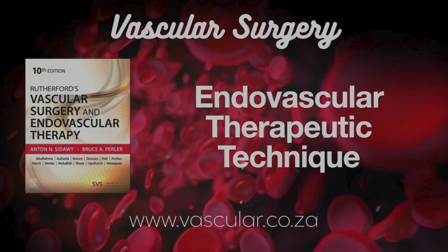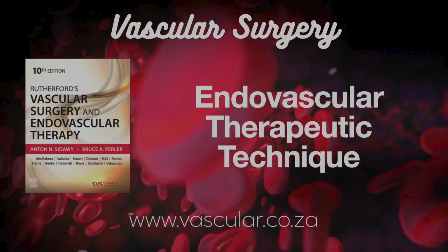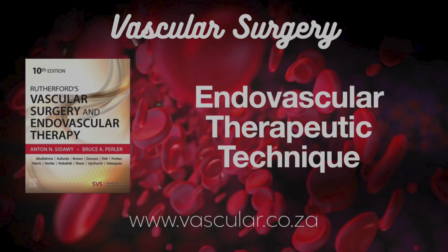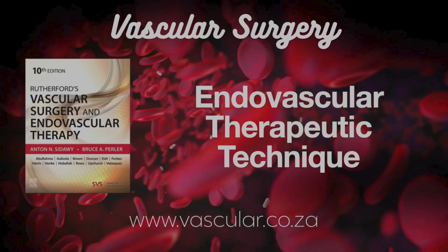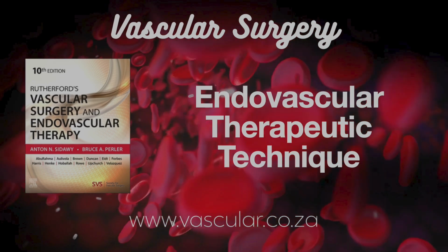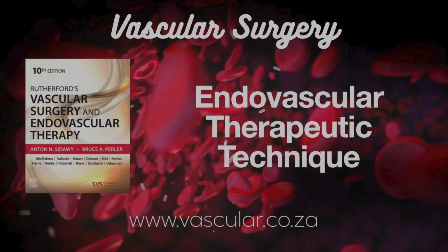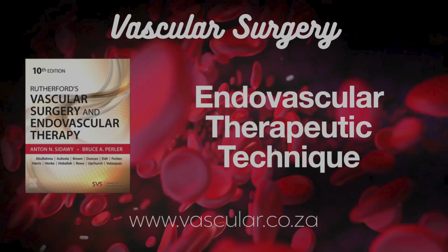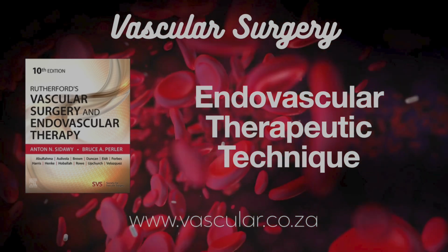Okay, access achieved. Next is getting the wire across the blockage. Principles, techniques. Core principle: get the wire through the true lumen, the original channel. Techniques vary hugely based on the lesion location, severity, CTO, plaque type. Thin wires, 0.014, 0.018 inch, often used for tight spots or CTOs. Support microcatheters help steer and support the wire. Staying in the true lumen is key.